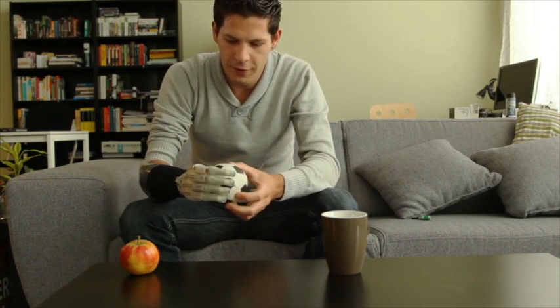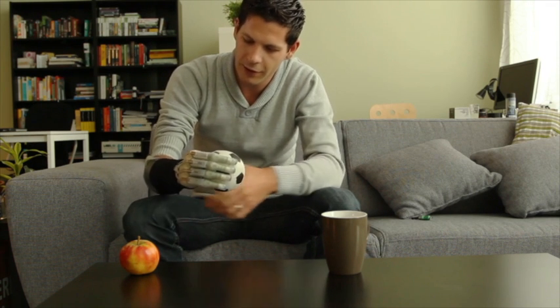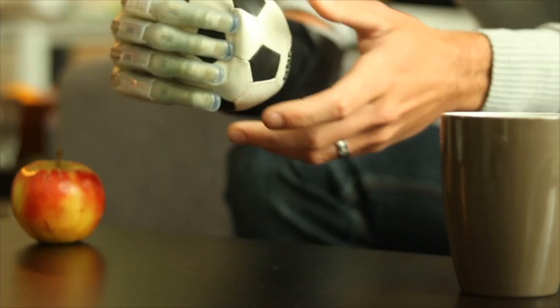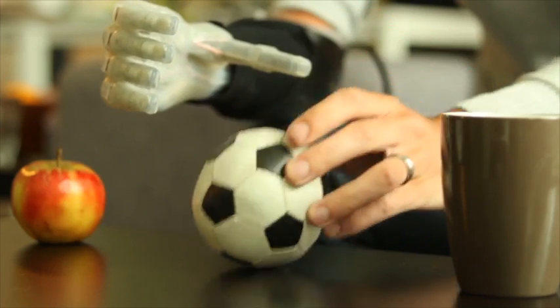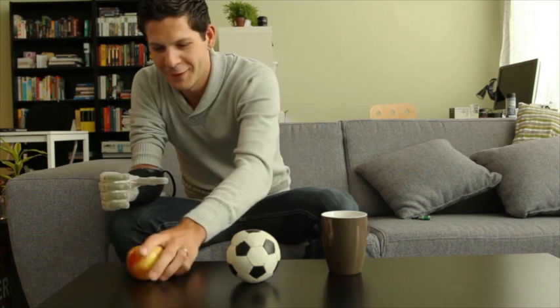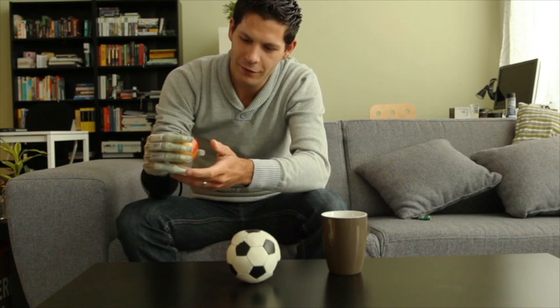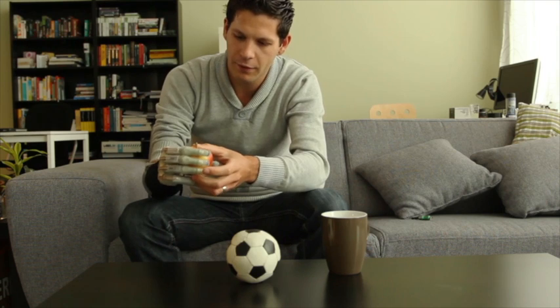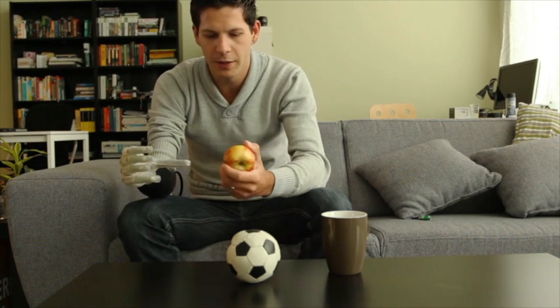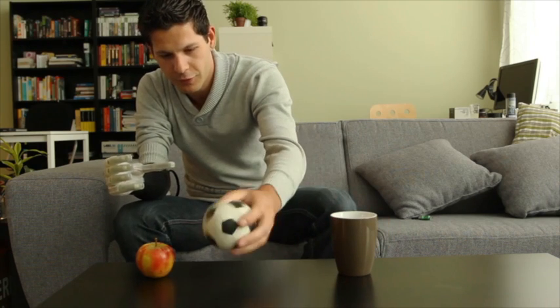When I grab this object, I immediately feel I have contact with all four fingers, but the vibration is less intense, so I feel I can tighten the grip. The shape is almost equal, so you immediately feel you have contact with three fingers in this case, but you can feel that you cannot squeeze it because the vibration is stronger. This sensation also enables me to feel the difference between a hard object or a soft object.